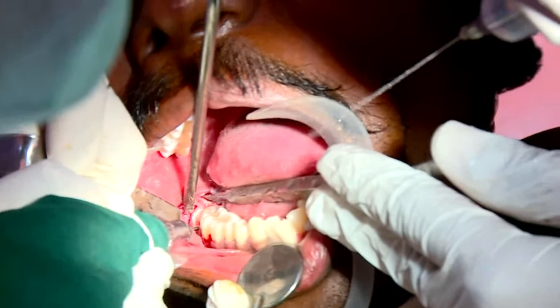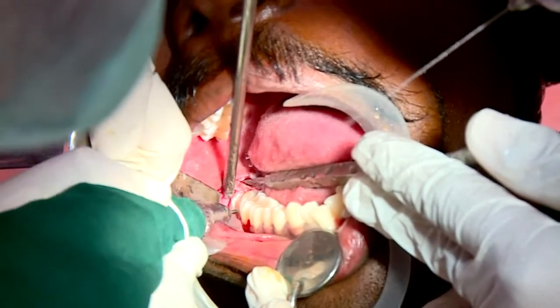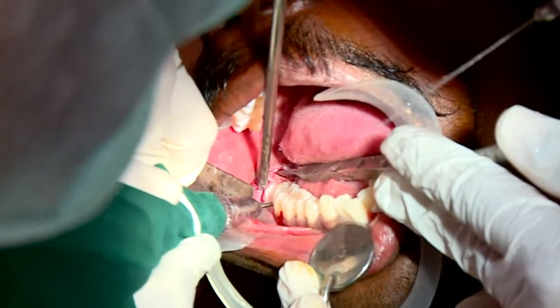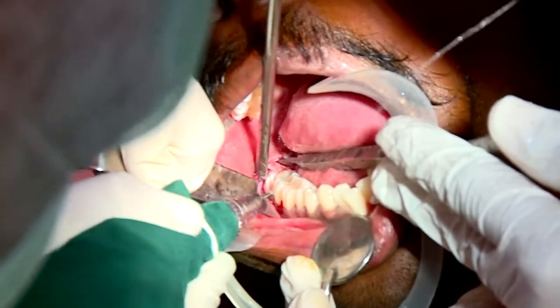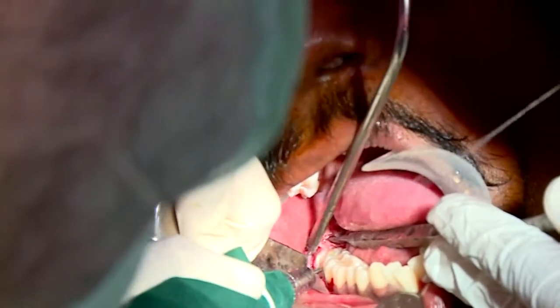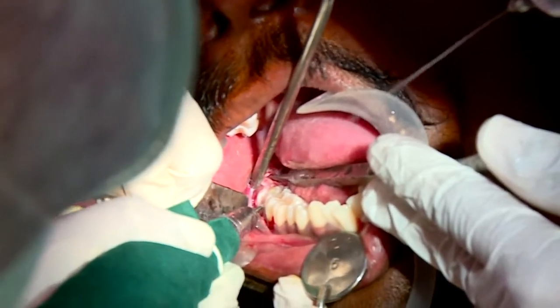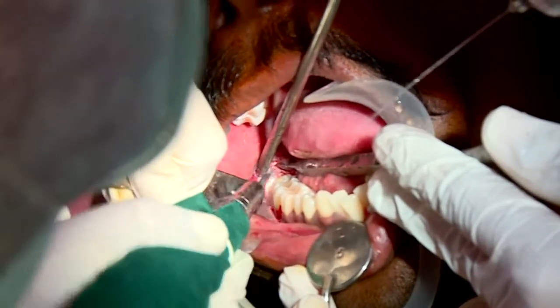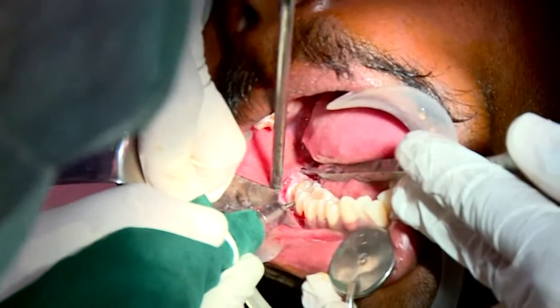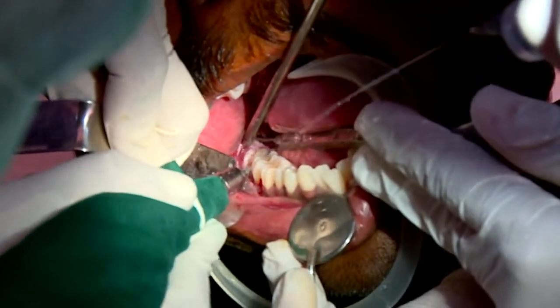Fine. Always remember, it's not excessive force. The tooth should be able to come out with minimal force. If not, you will have to think about what procedure you are planning on. Okay, always think of what you are going to do if it doesn't come out at the first plan level. Before splitting the crown, to make the removal of the tooth easier, once the crown is removed, after this it becomes easier to remove what is left.